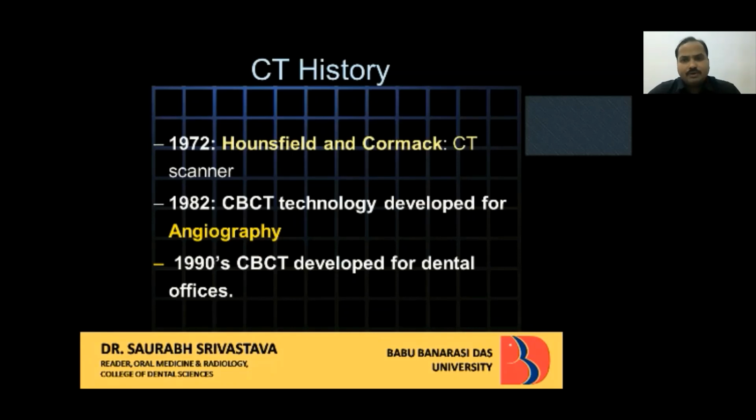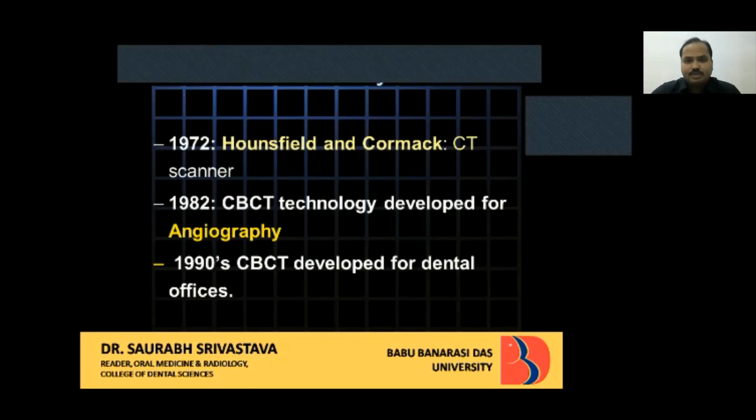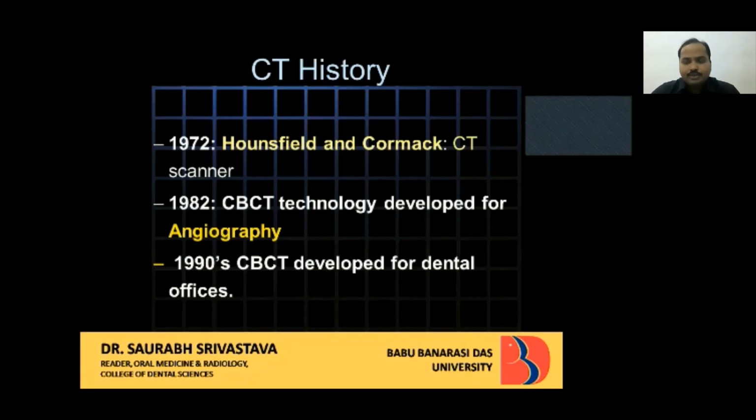So, as you have all gone through the topic of computer tomography, as the history says, computer tomography was developed by Hounsfield and Cormack in the year 1972. But 10 years later, CBCT technology was developed, and it first came into use for angiographic purposes. For dental use, it was taken into account in the 1990s, not before that time, because the machine was bulky. So much more advancement was made to make it apt for use in dentistry or in the dental office. So it came in around the 1990s.